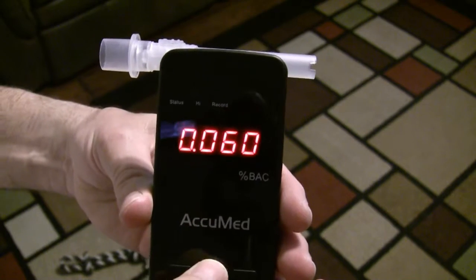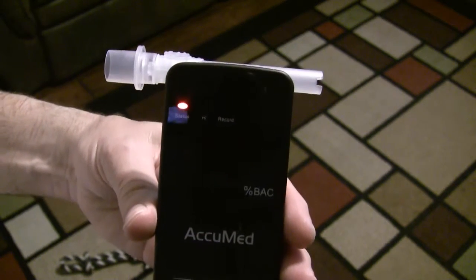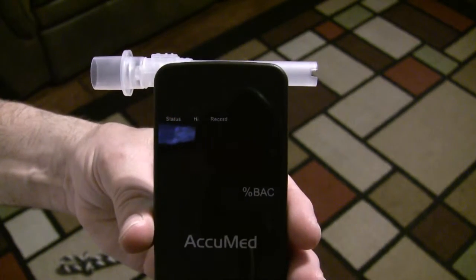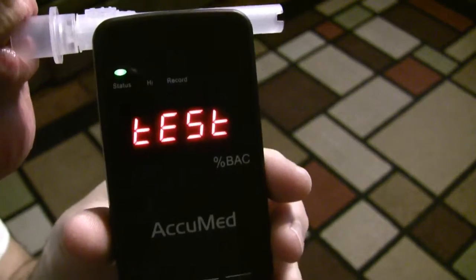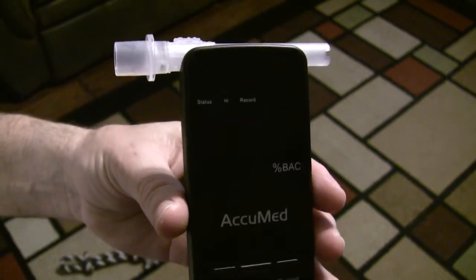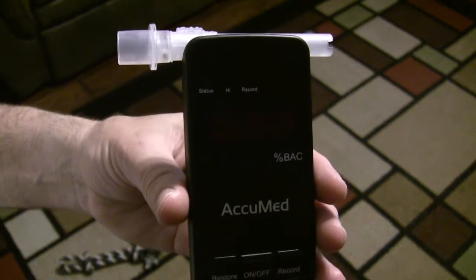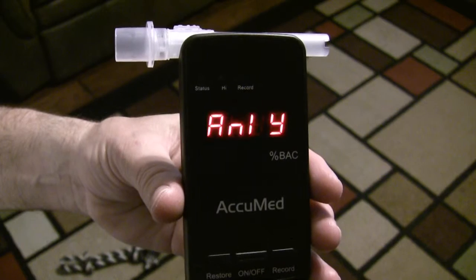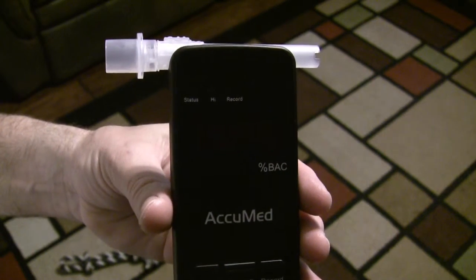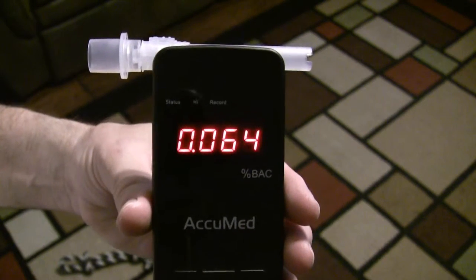Now they do say to do this twice, just to make sure. So I'm going to go ahead and run this through one more time — and no one tell my wife that I did this prior to picking her up. And 0.064, so they were pretty close to each other. I could probably figure I'm definitely a 0.060, 0.062, something like that.